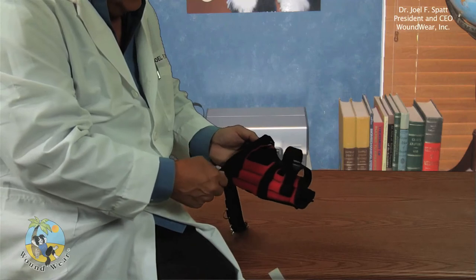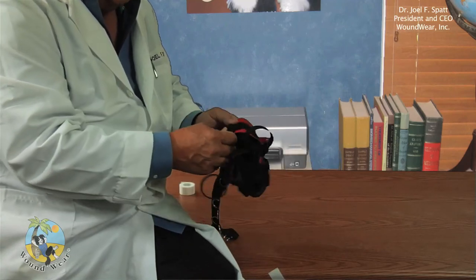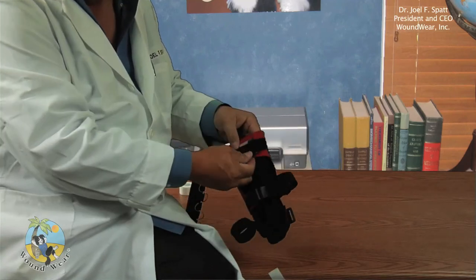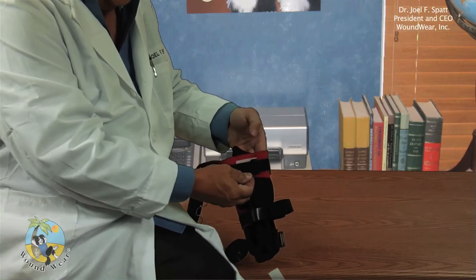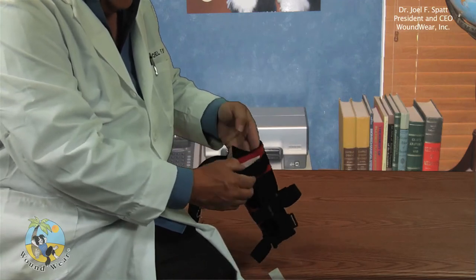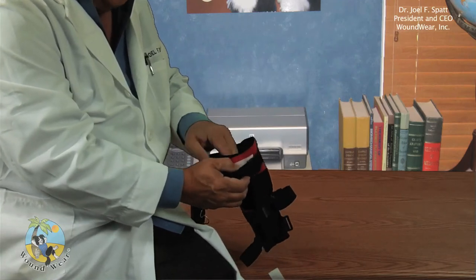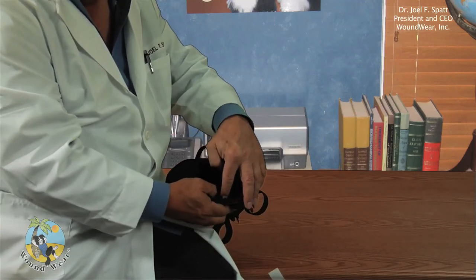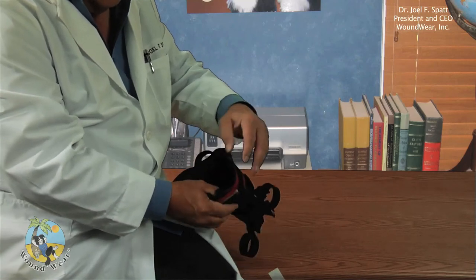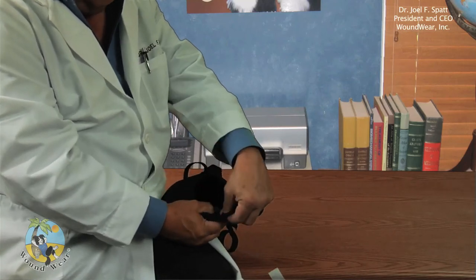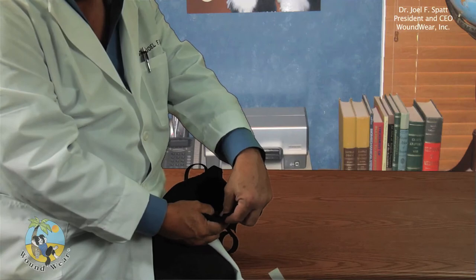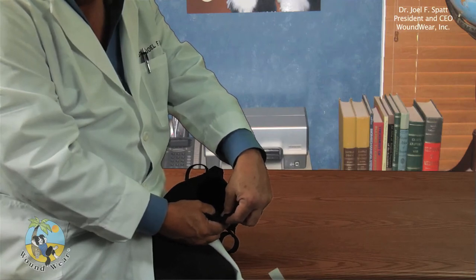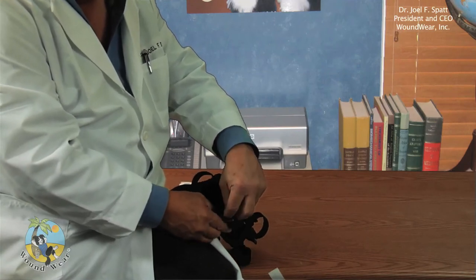So now I can get it to be that tight instead of having it buckle and not tightening around the back of the thigh of the dog. And you can see that it's now overlapped, and it's very comfortable because the inside is all lined with lycra, and it's a very smooth, soft material. So both of these edges are now overlapped, so we've got an extra inch and a half to two inches of further shortening.